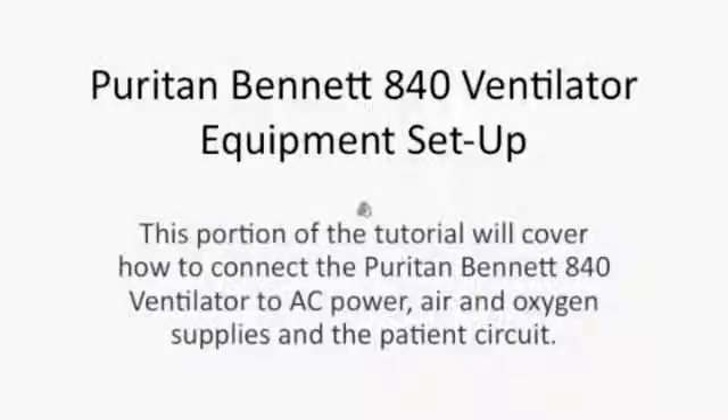Welcome to the Puritan Bennett 840 ventilator equipment setup. This tutorial will cover how to connect the Puritan Bennett 840 ventilator to AC power, air and oxygen supplies, and the patient circuit.